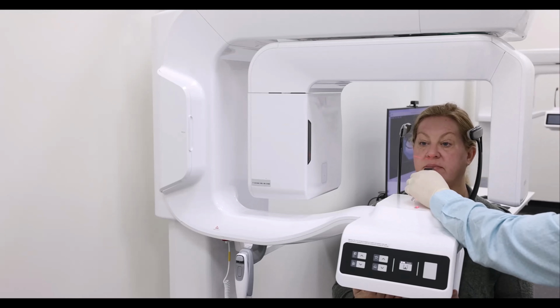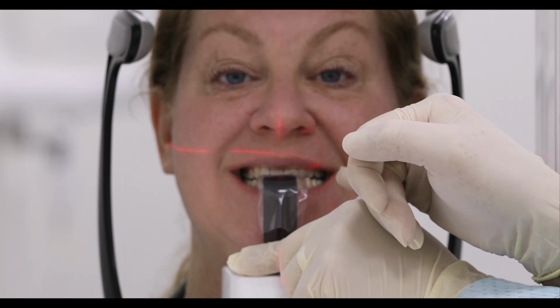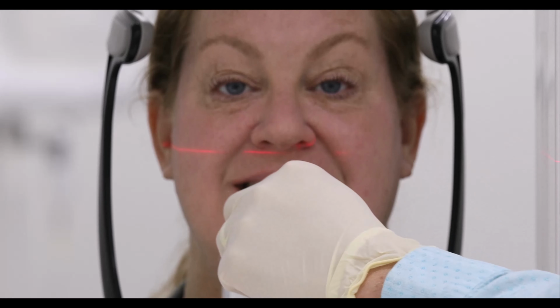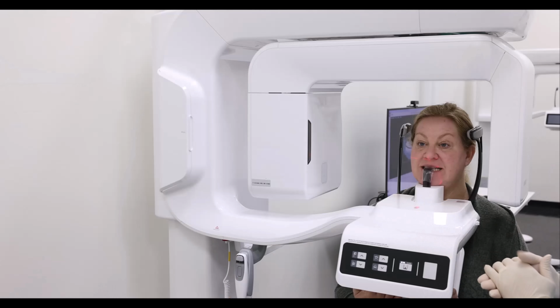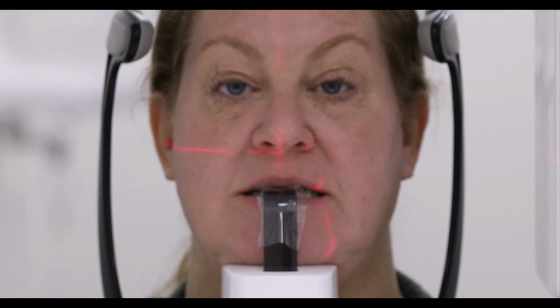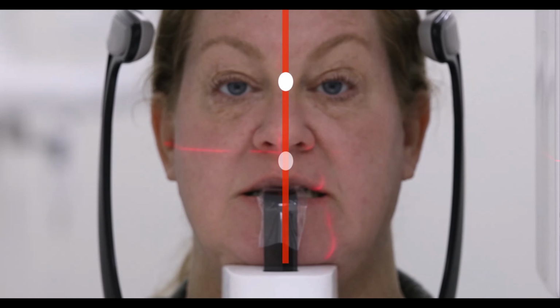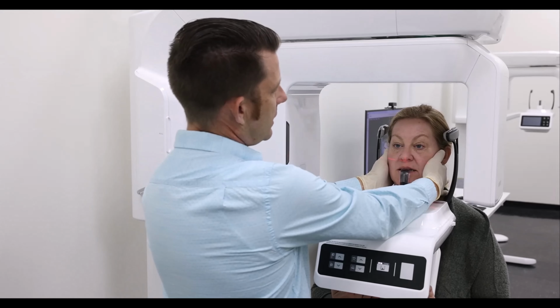And I'm going to go ahead and open and bite and smile really big. I can see the patient is in the bite stick groove. And chin's off the chin rest a little bit. I'm going to gently push down to ensure that chin is firmly on the chin rest. So 3 steps in positioning for our panoramic. First, I'm going to start with my mid-sagittal beam, ensuring the patient is lined up center, looking right between the eyes and right through the philtrum. If I do need to move that, I'm going to go ahead and physically move the patient's head to make sure she's lined up center.